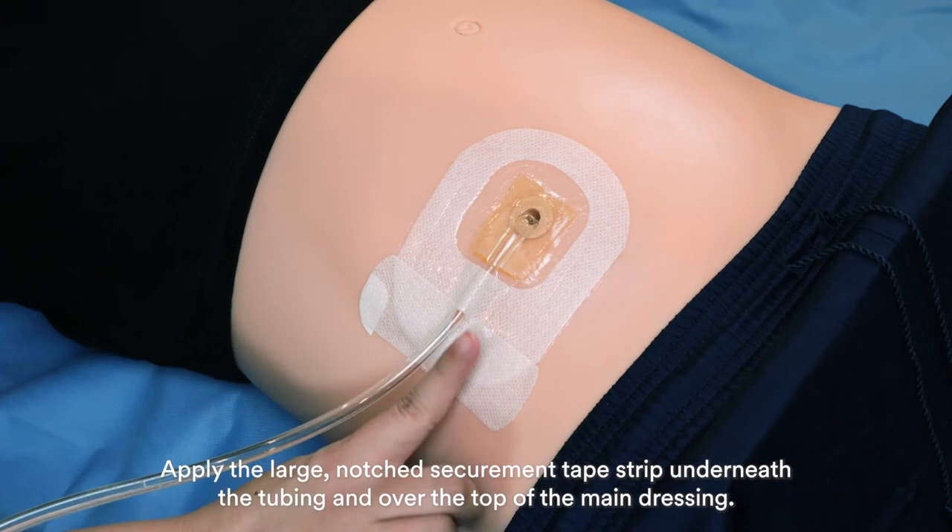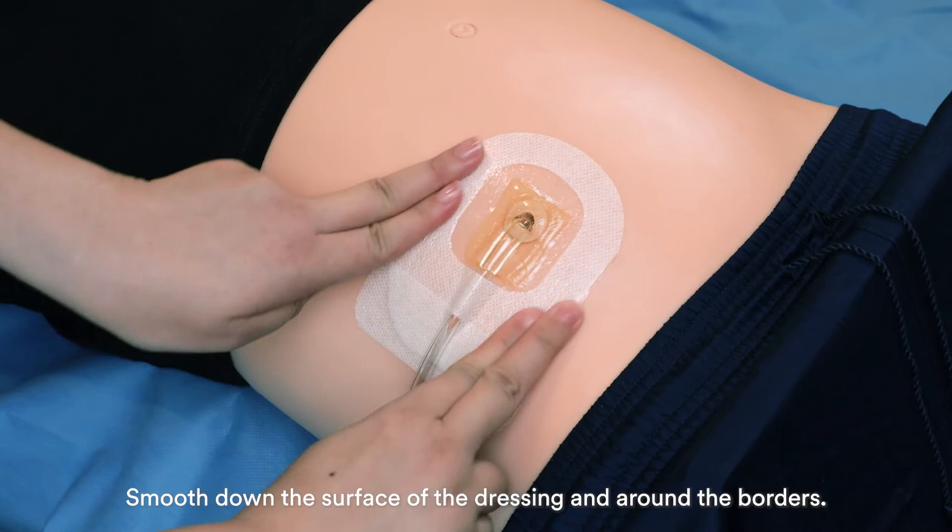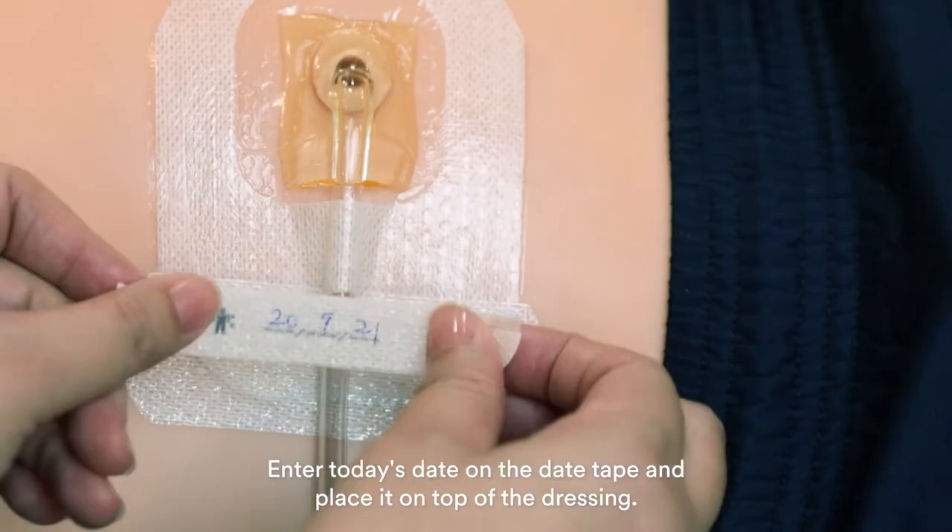Apply the large notch securement tape strip underneath the tubing and over the top of the main dressing. Ensure the dressing is securely attached to the skin and tubing. Smooth down the surface of the dressing and around the borders. Insert today's date on the date tape and place it on top of the dressing.